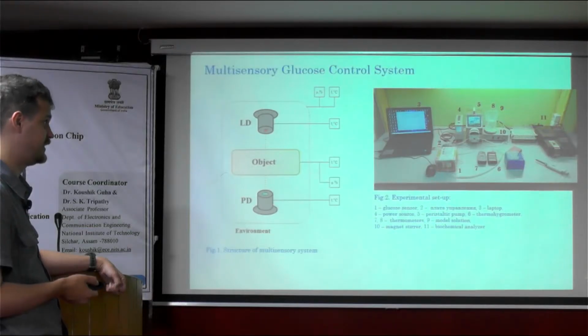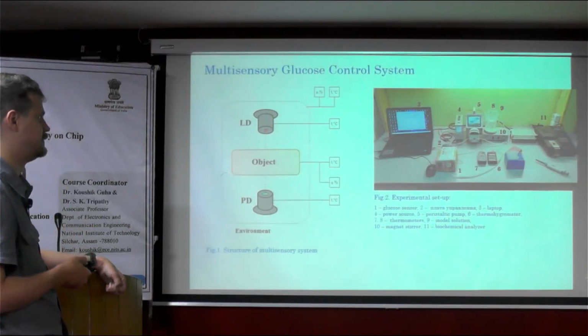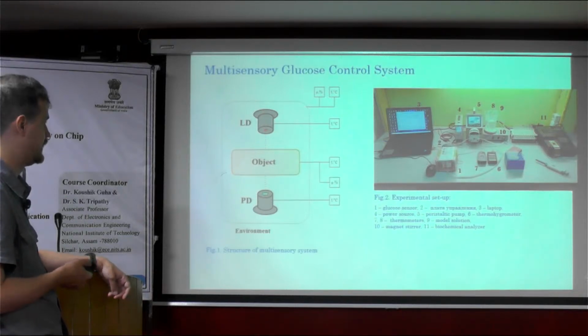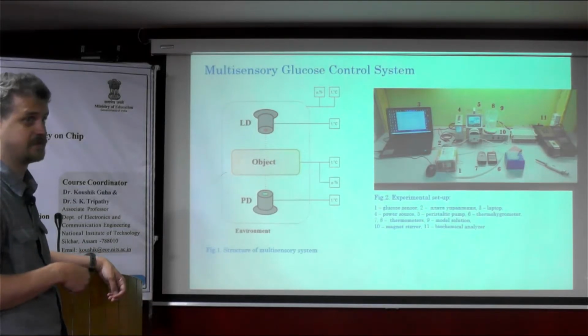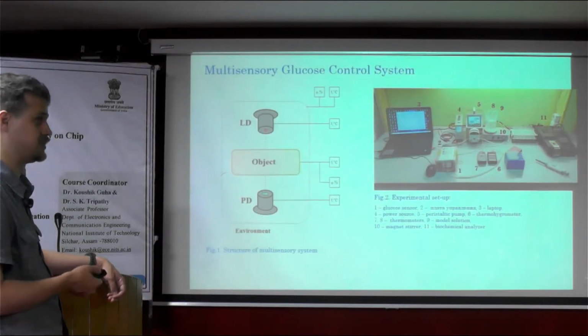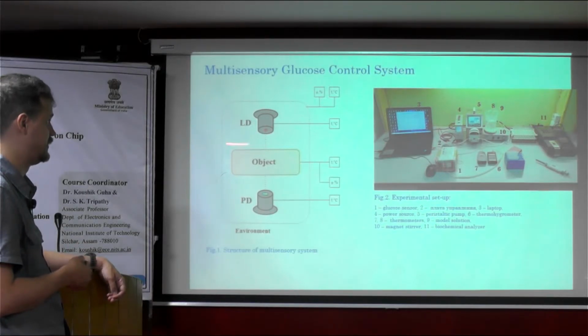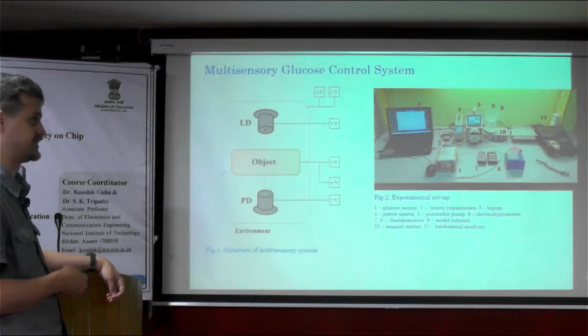Usually in this experimental setup, we use a quartz tubule and we pump a solution that imitates blood or any biological fluid that exists in the human organism, and we obtain the data. We had to control the temperature of the sensor, because any shift in the temperature of the diode can lead to distorted results. So we had to cool down this system. The main problem with the approach that we use is that this particular system requires cooling.